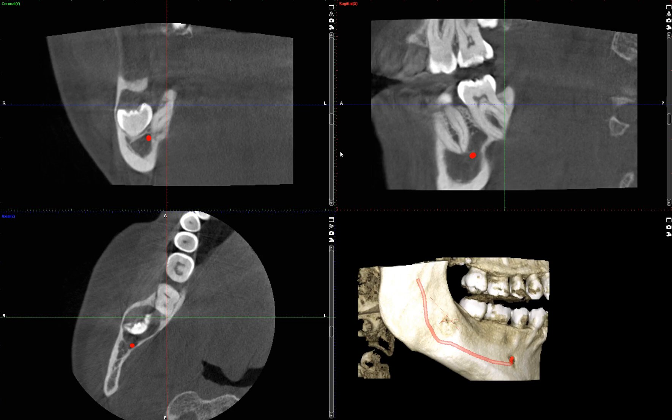A 41-year-old asymptomatic female patient presented to our clinic. She was referred from outside to our faculty practice. The patient has never really had any dental caries, from what I've been told, and her outside dentist discovered there was some type of a potential lesion in the area of tooth number 32.